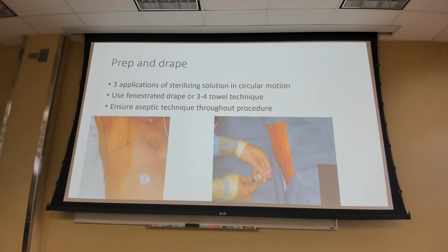And then you want to ensure that it is an aseptic technique. So it is a sterile technique. You are going to be wearing your sterile gloves for this, not your exam gloves. So typically, when we run the trauma room, I have a scalpel in my pocket and my sterile gloves, still packaged, in my pocket. This is typically an emergent procedure, so we're prepared for this prior to any patient presenting to the trauma room.